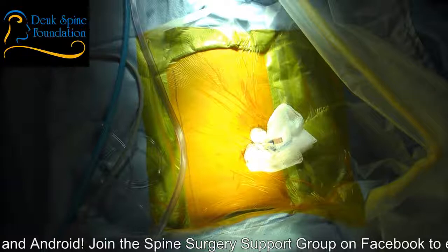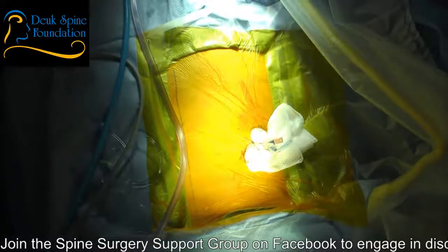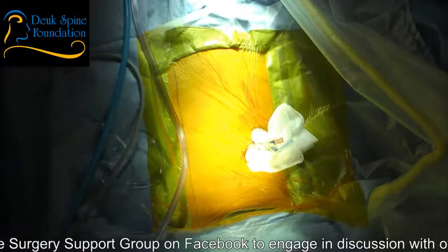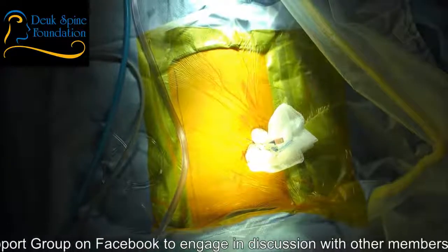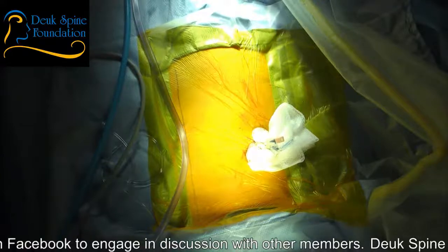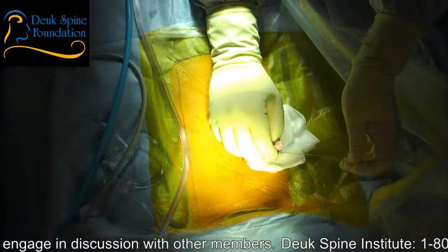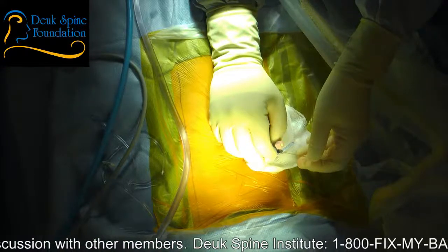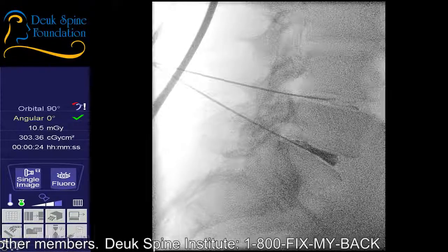Let's move the fluoro south 1 inch, just barely. I want to be able to see that 5-1 disc better. All right, that's good, right there. I can see the pseudo disc, the fake disc. It's the next one down. So I know I'm in the right place. I can see the herniation. This is what you call a grade 5 tear. It's the worst tear you can get, and it's got a big herniation associated with it, extrusion. That's what he's got. Let me know when he's asleep.